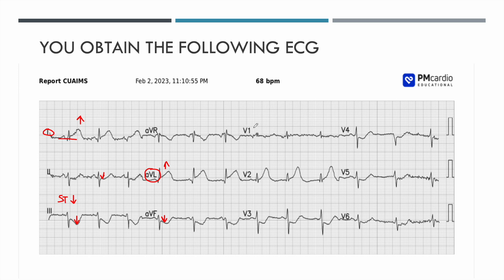Moving on to the precordial leads — we have a little bit of elevation in V2. That's interesting because V2 is not contiguous with leads 1 and AVL, which are looking at the lateral wall. V2 is looking more at the septal wall, so it's not contiguous. That's kind of a strange thing to see.